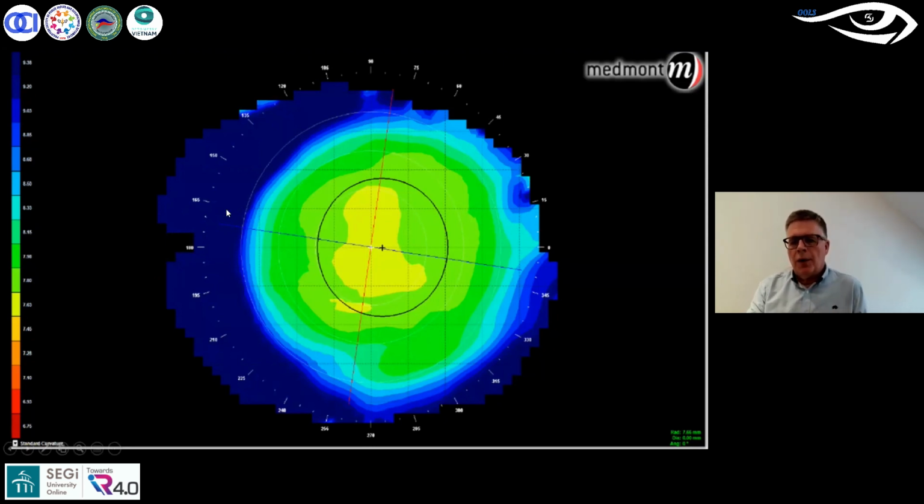But then when we go further out towards the periphery, we can see that the cornea flattens out quite considerably. And this marker here, and we will cover this in a second, this is a 7mm marker, this faint line here. And beyond 7mm, the cornea becomes rather a flat tangent angle. There's much research on this over the past few years.